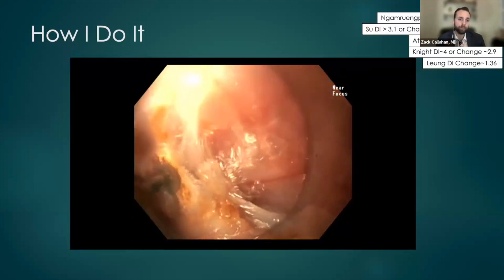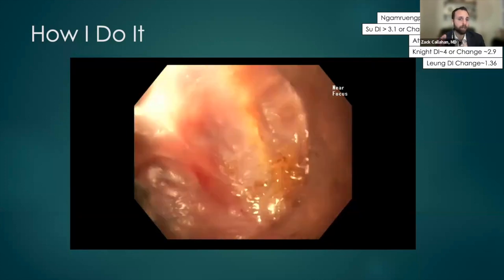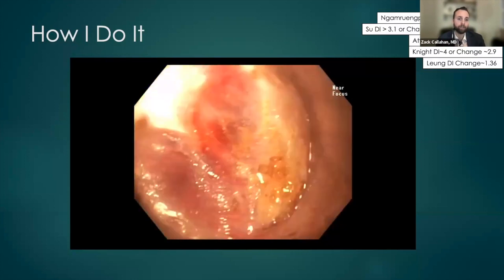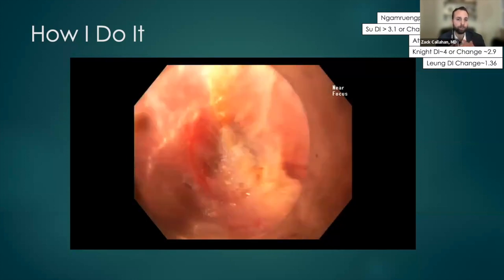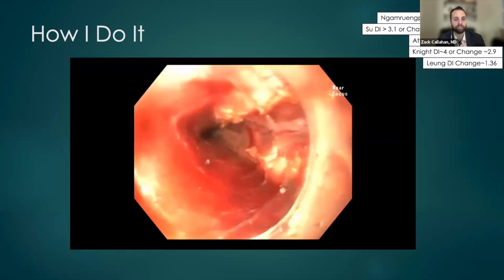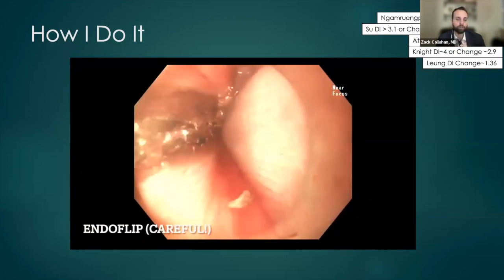And then just to point out, it's not uncommon. You can see here, this is probably a little full thickness. And I've noticed that just tends to happen. The longitudinal fibers, certainly down closer to the GE junction, tend to get kind of thin. And it's not uncommon to see the heart or some lungs over there.